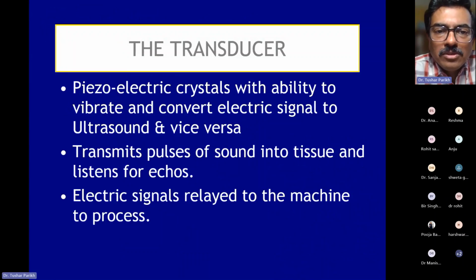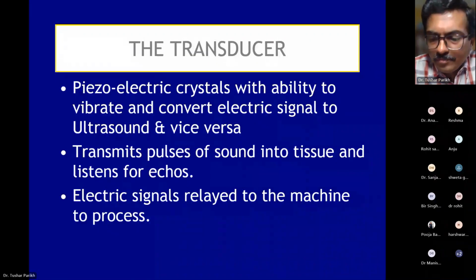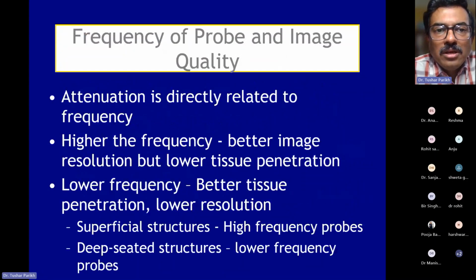Now there is something called a piezoelectric crystal, which has an inherent ability to vibrate and convert an electric signal into an ultrasound signal and vice versa. So whatever reflected ultrasound wave comes back, it converts into an electric signal and presents it on the screen. And the electric signals are relayed to the machine to process.